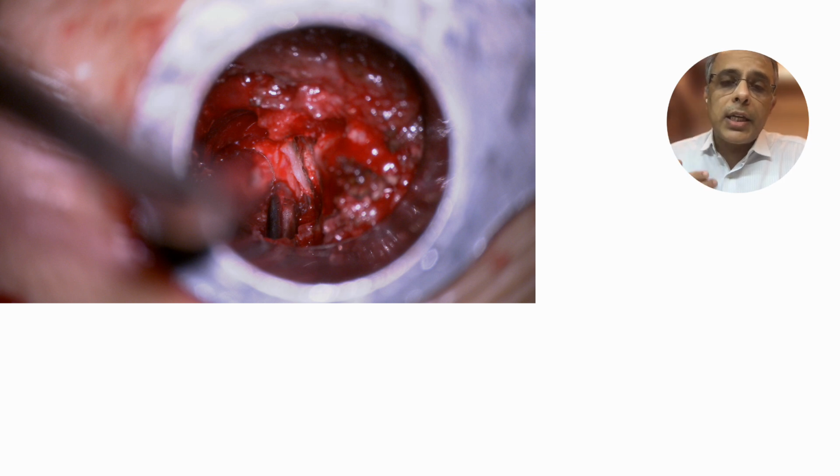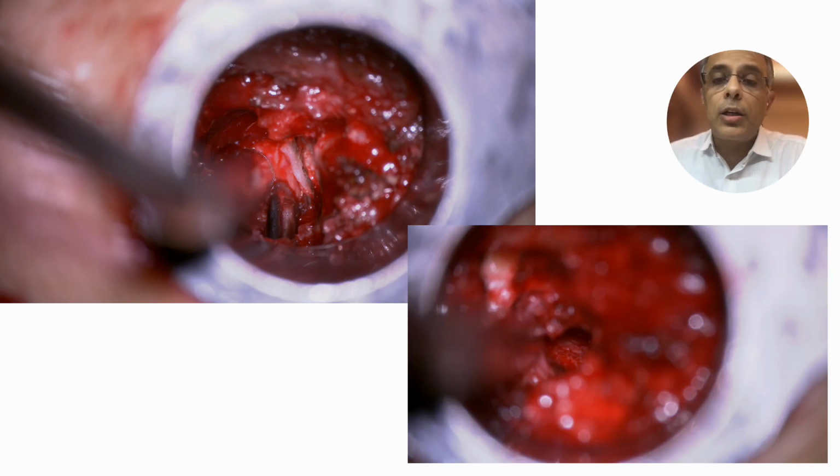In my initial cases, I looked to see how the ENR would be when I'm inserting the guide wire. This particular image shows that I have docked this tube on the facet joint. I have done a SAP excision like we do in MIS TLIF, and I have seen that from where the guide wire is entering, there is no exiting nerve root visible, and this is the disc space and this is my guide wire which goes inside the disc space. So it is scary, but if you look at it, it is much safer than it is actually thought of.